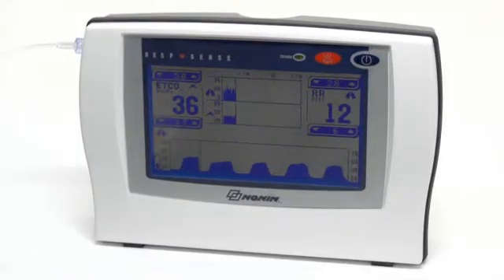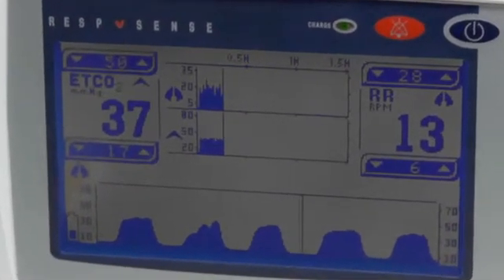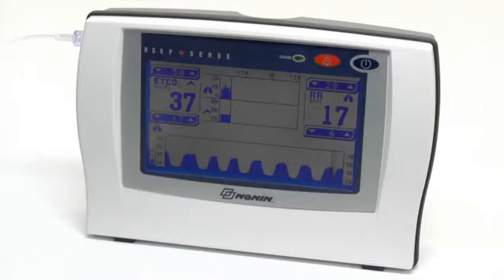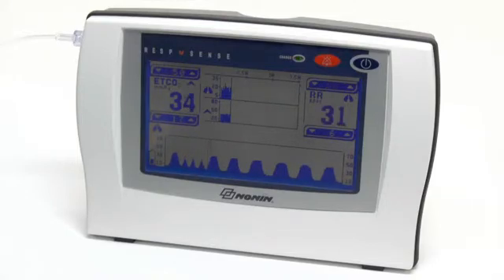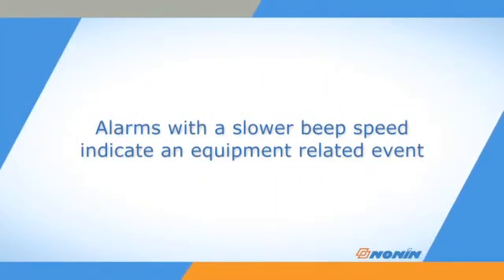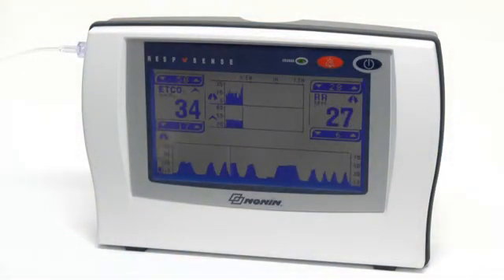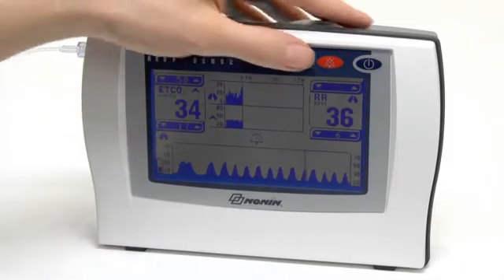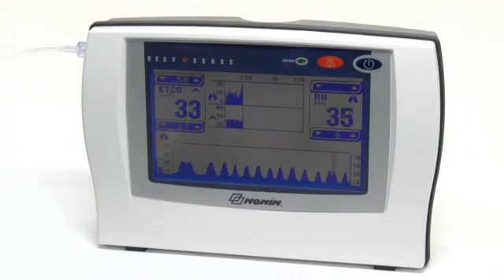The monitor is now ready for use and will display the patient's end-tidal CO2 value and respiration rate on the screen. The trend graphs indicate end-tidal CO2 and respiration rate trends for the last one and a half hours, with markers at half-hour increments. The monitor will alarm if end-tidal CO2 or respiration rate goes outside your set limits, or if no breath has been detected for 25 seconds. You will hear a rapid beep sequence and see a flashing limit-exceeded message on the display. Other alarms with a slower beep speed may indicate an equipment-related event to resolve. You can silence the audio alarm for two minutes by pressing the alarm silence button; a second press resumes the audible alarm.